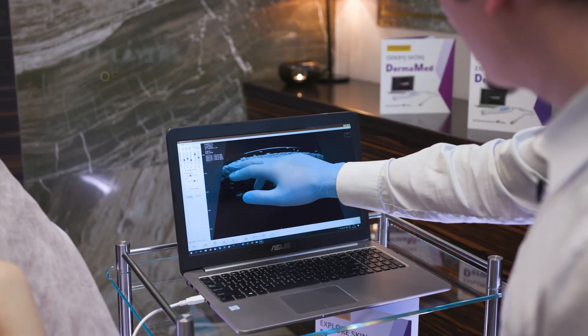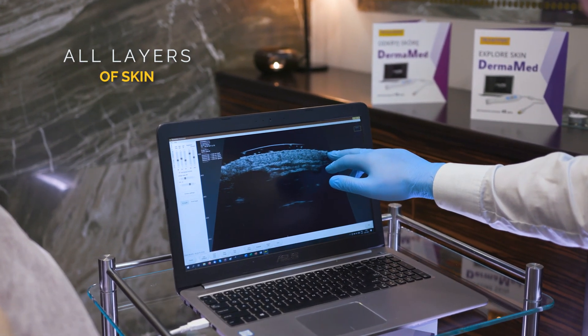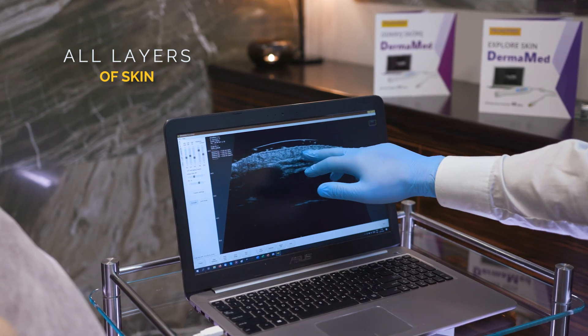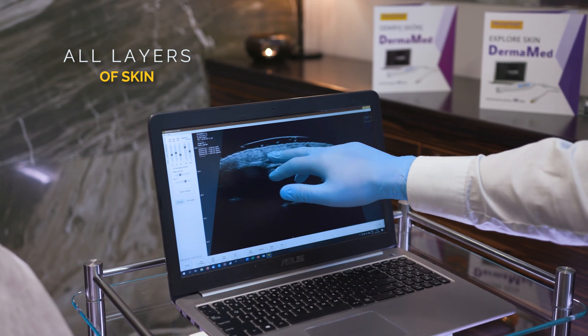On the screen we can see a very bright primary line. This is the epidermis. Here we have a slightly darker, homogenous layer. This is the dermis, with clearly visible hair follicles.